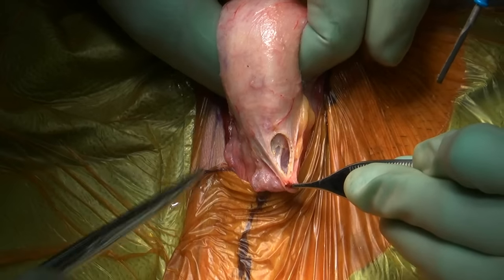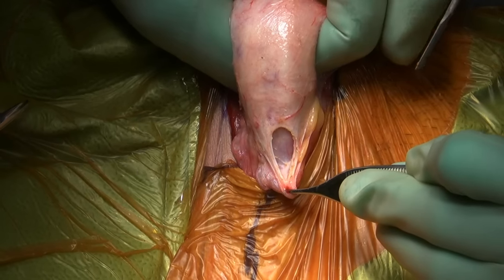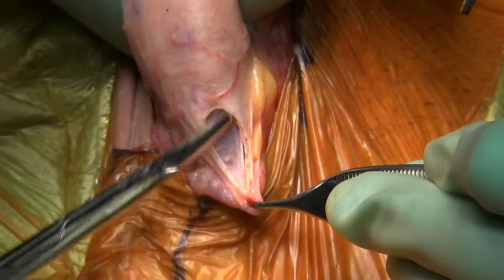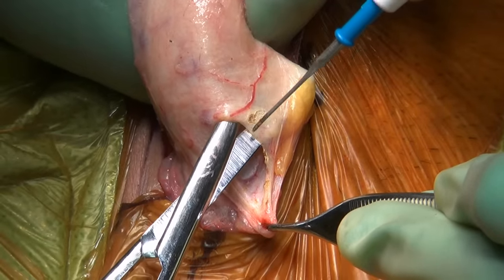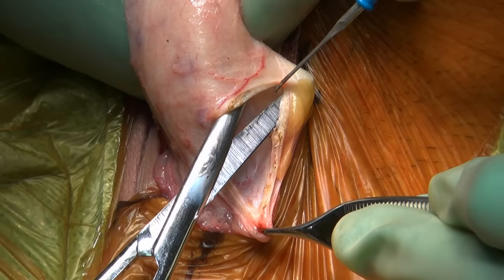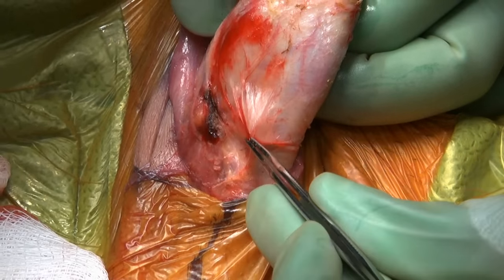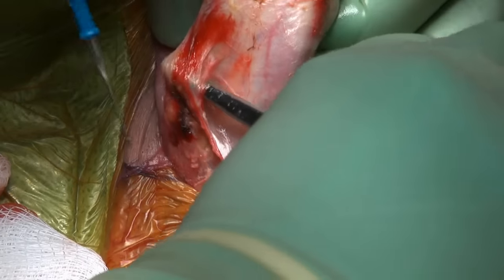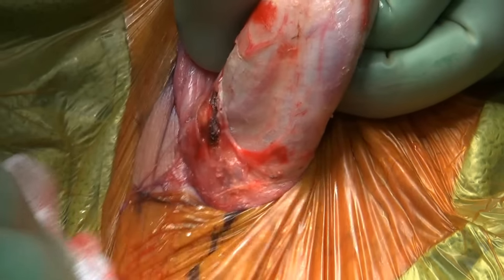I choose to use a 6-inch Metzenbaum scissors and incise Buck's fascia directly down to the urethra, or corpus spongiosum, which you can see immediately here. This is our best anatomic indicator of being in the correct surgical plane. I then release Buck's fascia over the corpus cavernosa on each side. There is no absolute need to make the corpora cavernosa pristinely clean as long as you can make out all important anatomic landmarks needed to safely and accurately position the corporotomies.